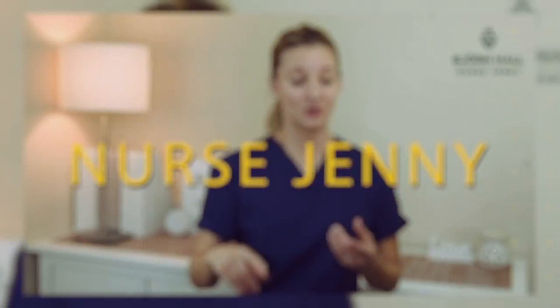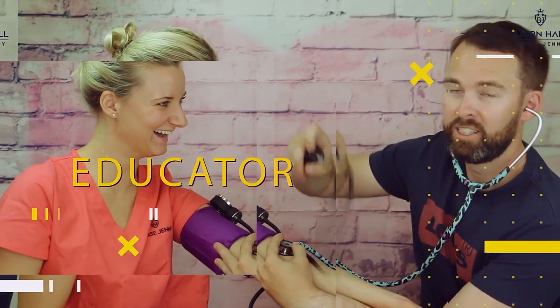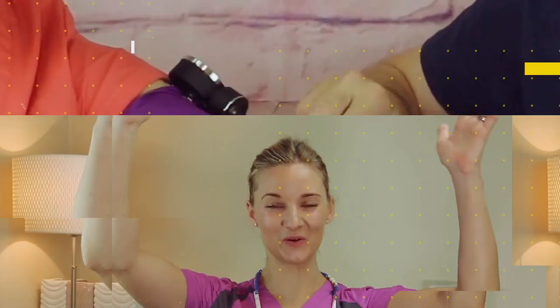The Björn Hall matte black stethoscope. Let me introduce you to the latest member of my Björn Hall family, the matte black stethoscope.